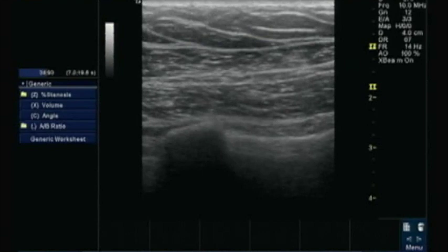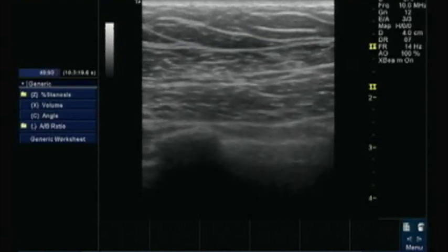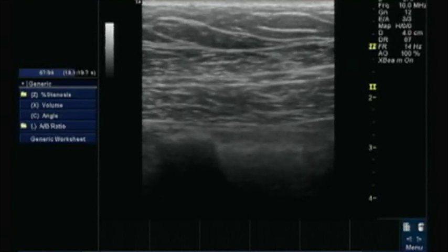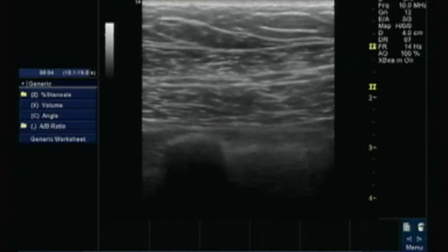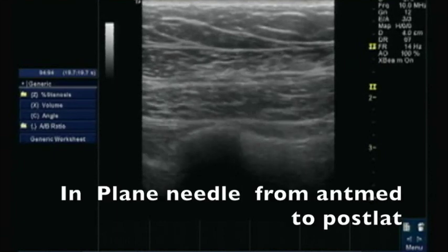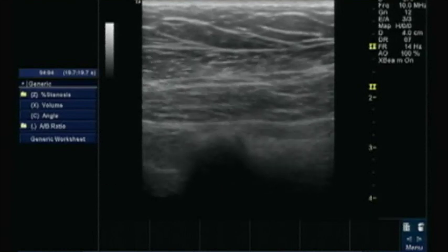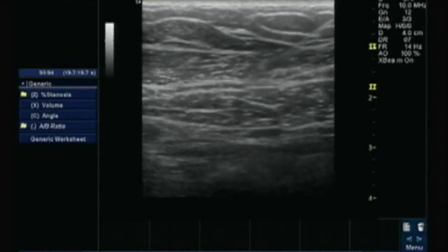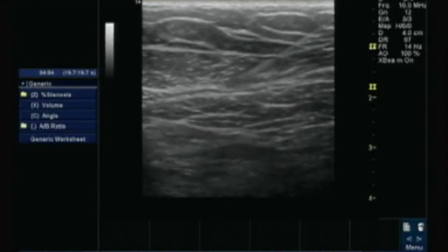So you have to inject the drug here to block the lateral pectoral nerve and medial pectoral nerve. This block is basically used for small surgeries like small fibroadenoma excision or putting an implant to provide analgesia — this is part of multimodal analgesia. Here you can see my needle is coming from anterior to posterior, or anteromedial to posterolateral. It is an in-plane approach.